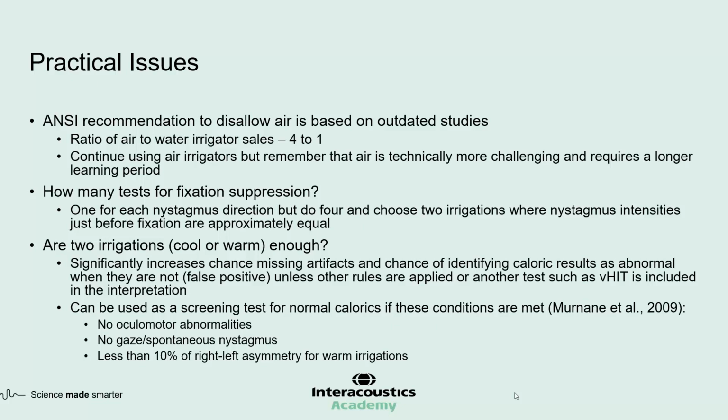How about doing monothermal calorics, cool or warm? Is that enough? Well, you should realize that you can do monothermal, but if you use the standard parameters, normal values, your false positive rate will be very high. You also will miss the opportunity to identify some of the artifacts.